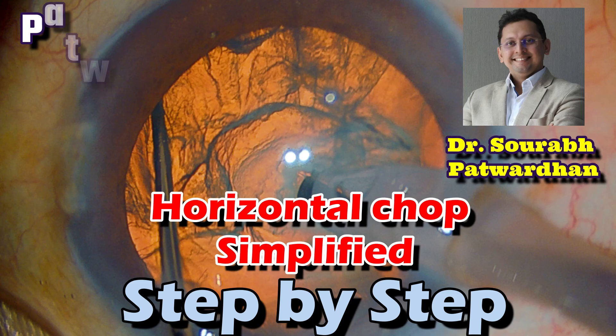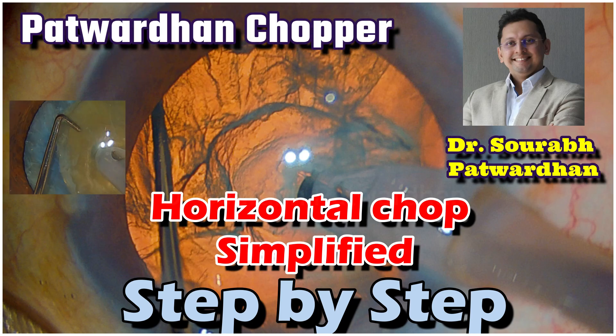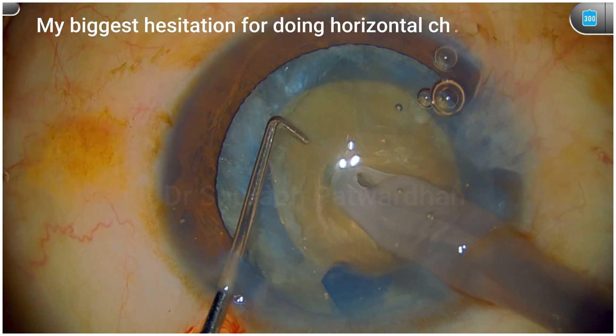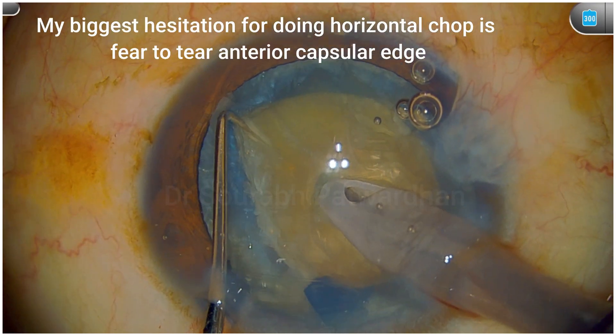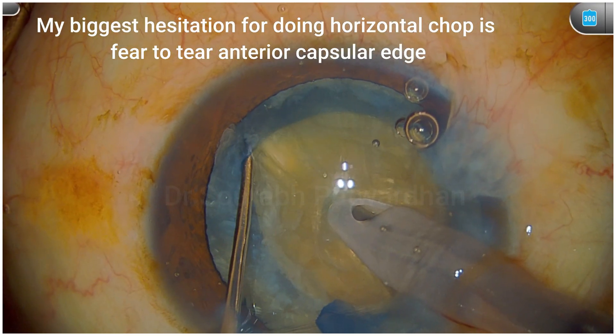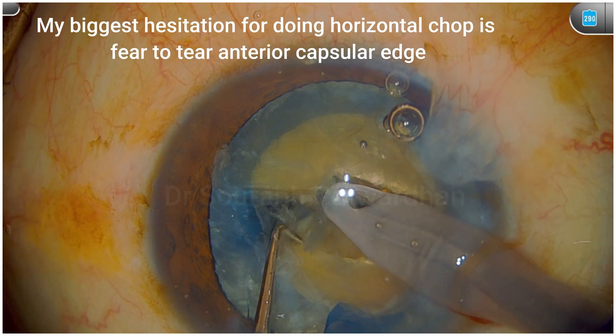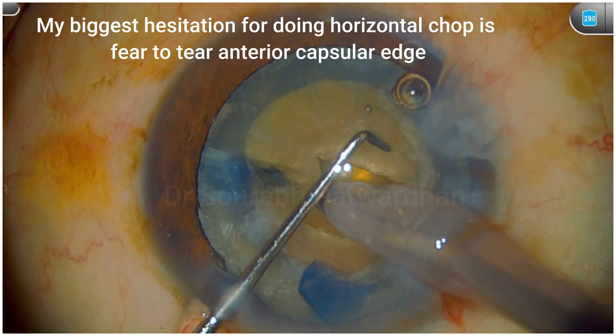In this video, I am going to show you how to do a horizontal chop in a very simplified way, step by step. I am going to use my own chopper, the Patwardhan chopper, which is 1.5 mm long. The biggest hesitation whenever I am doing horizontal chop is the fear that I will tear or damage the anterior capsular edge or the CCC edge.